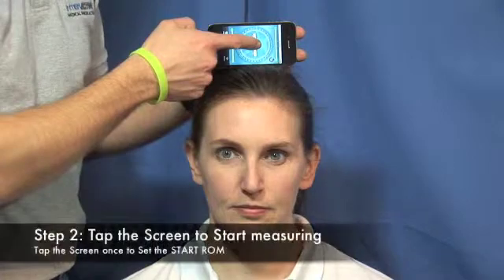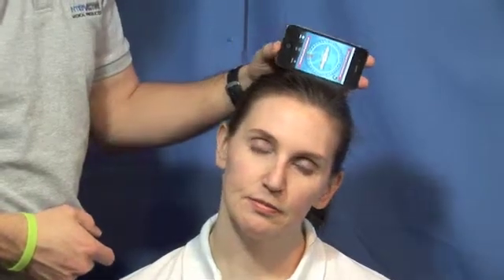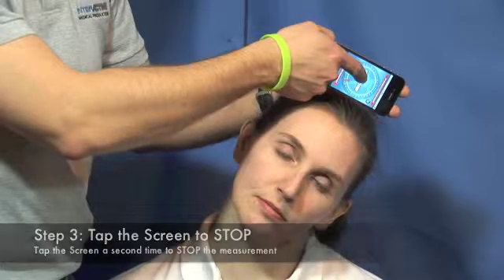To begin your range of motion measurements, tap the screen. Allow your client to slowly move through their full range of motion. At their end range, tap the screen again to stop the range of motion measurements.